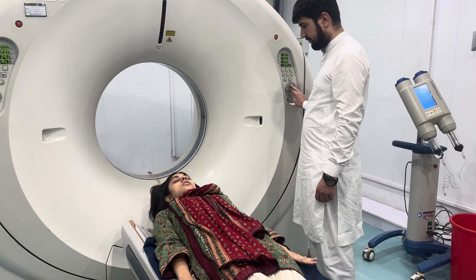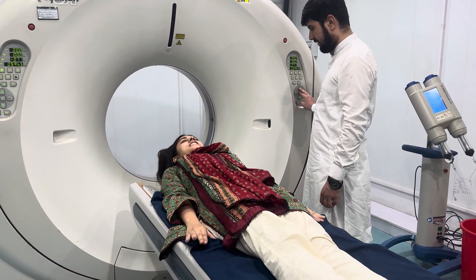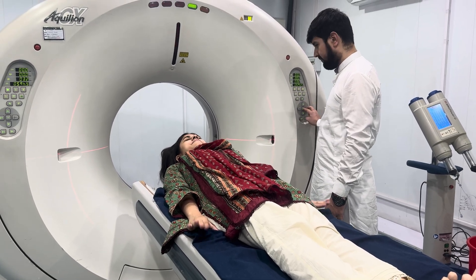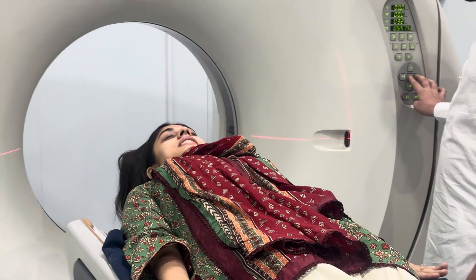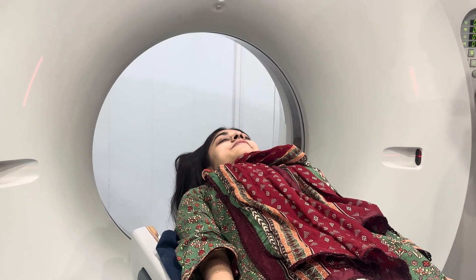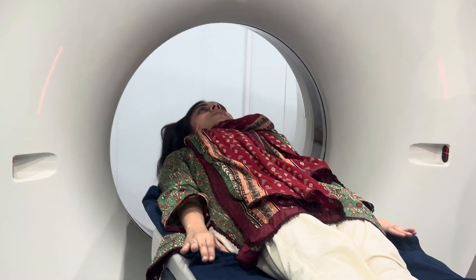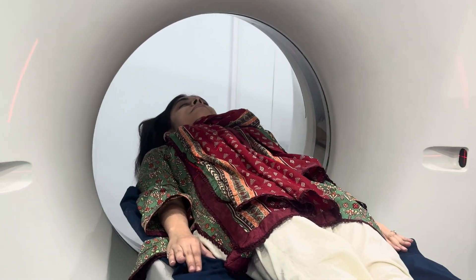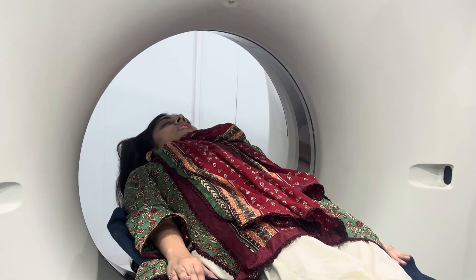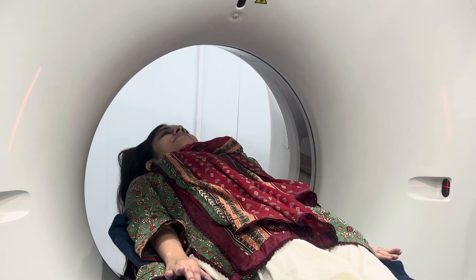Why is this so important? Because when we do cochlear implant planning we need to know the exact course and demonstration of the cochlea, the round window, oval window, and the relation of the facial nerves. The semicircular canals are equally important in balance disorders, congenital malformation, or cholesteatoma evaluation. 2D CT images may not give a complete view. That's why 3D reconstructions of high-resolution temporal bone CT has become a game-changer, especially in implant patients.